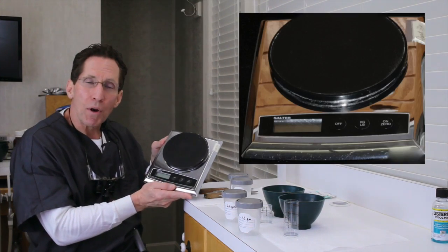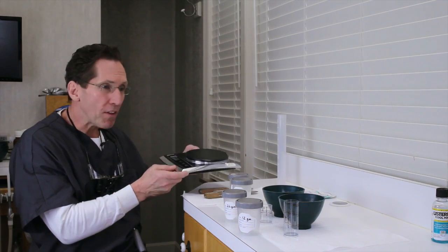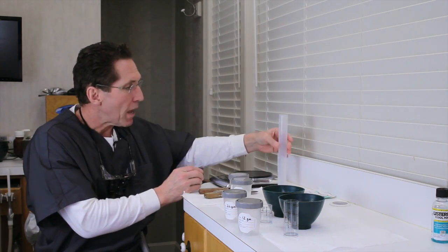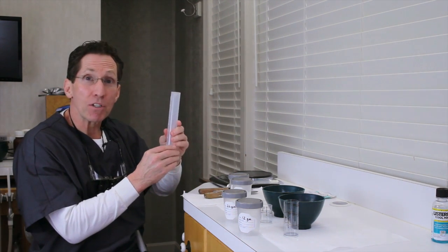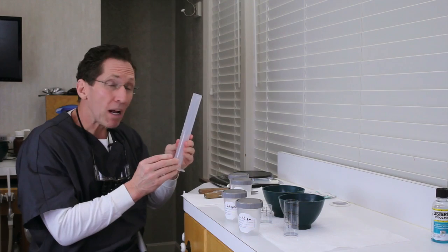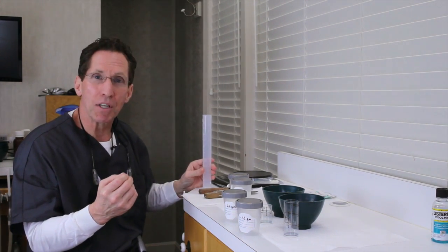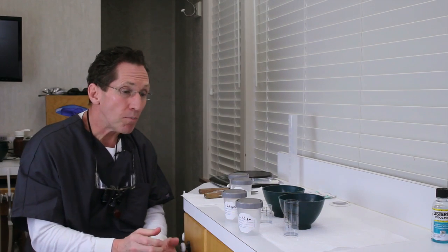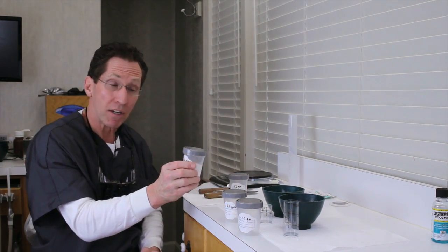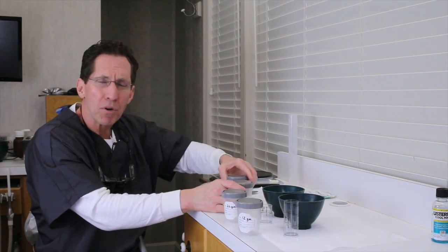We have a little tray, a little scale I got from Bed Bath & Beyond for weighing out our alginate, and all this stuff is pre-measured. We have here our water volume measure, and we use that just to determine, first of all, that it's the appropriate amount. To make things easy, I believe that consistency and predictability in virtually anything we do are wonderful qualities, and we try to make things as easy as possible. One of the things we do, first of all, is we go ahead and pre-measure all the powders. And again, those powders are measured on these little scales. And so we know we have precise measurement.